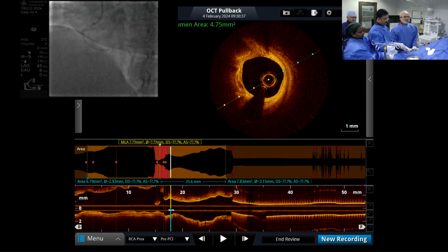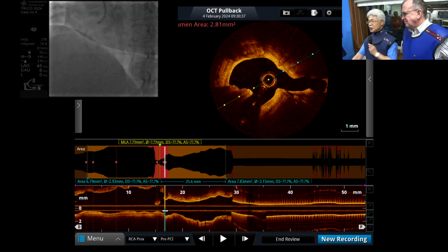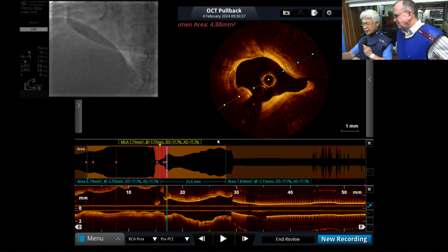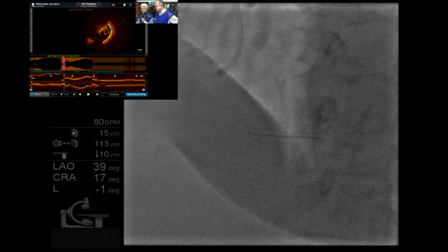Yes, rota. Simple nodular calcium, we cannot identify any shadow behind the wire, right? Let us look like this. This is nodular calcium. Recently, in the CRF group's classification, this is a non-eruptive calcified nodule, but we can identify lots of shadow similar to red thrombus.